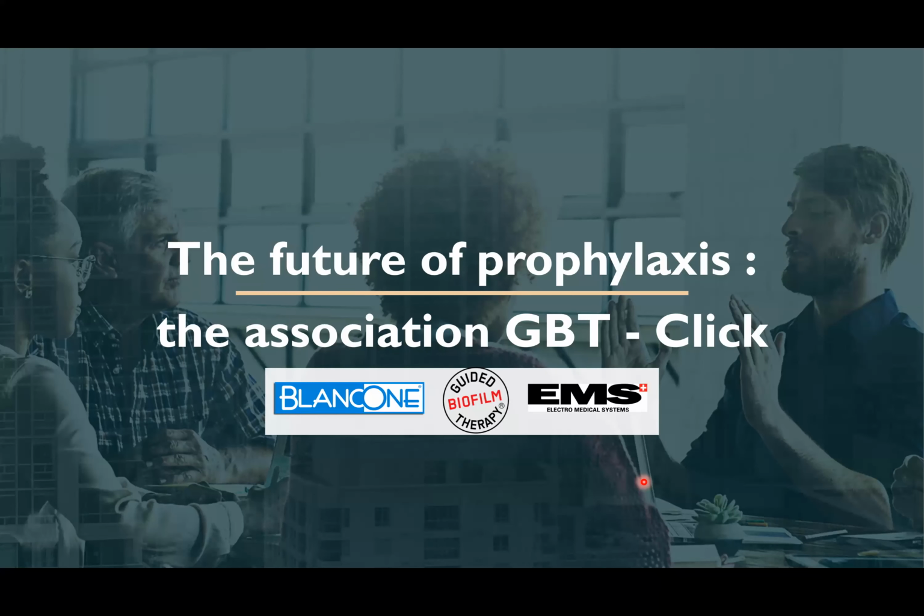So today I'm going to talk about the future of prophylaxis. Like Andrea said, I'm mixing the two techniques, the GBT and the Click, to provide a good result for my patients, but also to provide the minimal invasive treatment. And why interact these two techniques? Because to have a really good result in whitening, we need to start with the basis, and the basis is prophylaxis. We have to get a good foundation, a clean one, to expect the best result as possible with Click.